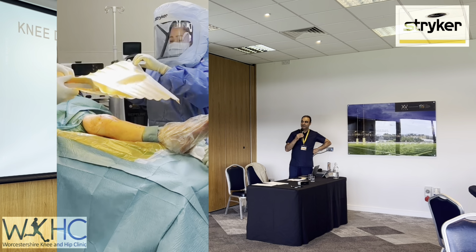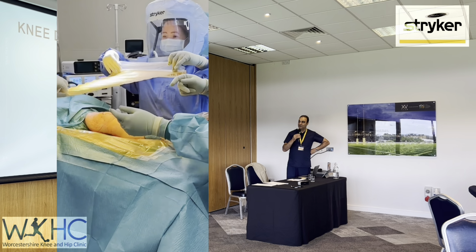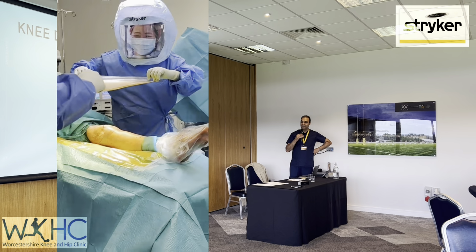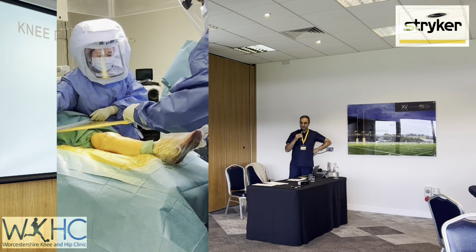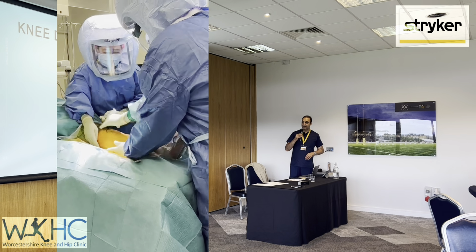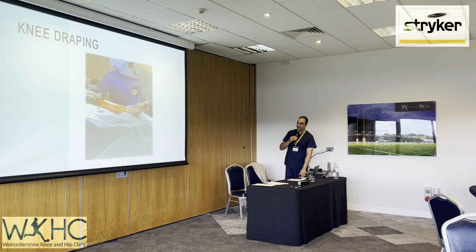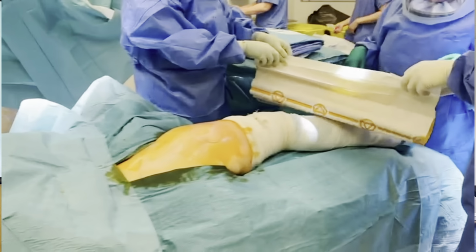Most surgeons will put a stockinette on, put a crepe bandage on, and the problem is you can't reference through that accurately. So we're putting the drape on there, we're going to put that on top, and that seals the knee very nicely. I think it's quite an important tip because it allows you to reference the malleoli much more easily. So we put that on and we're able to do that. And you can see we put that down and we can feel the landmarks, we can feel the ankle. So we're pretty confident that when we're on the ankle joint, we know exactly where the medial and lateral malleolus is.